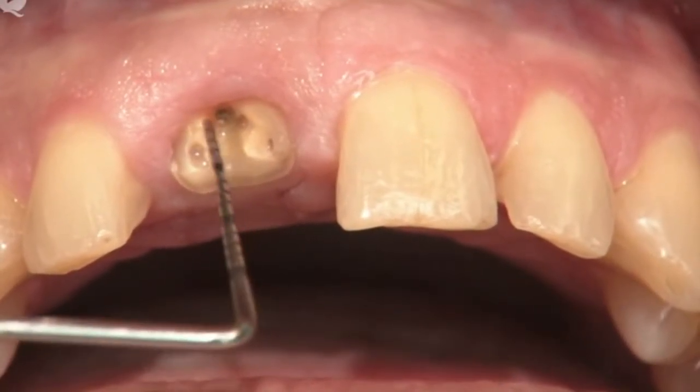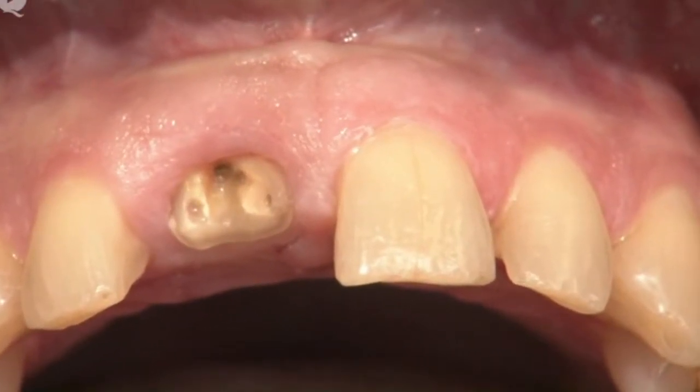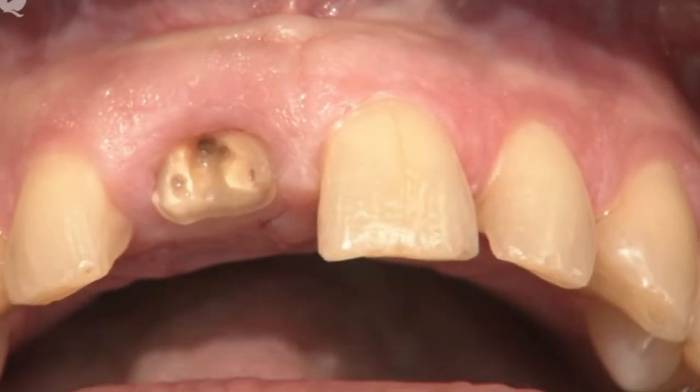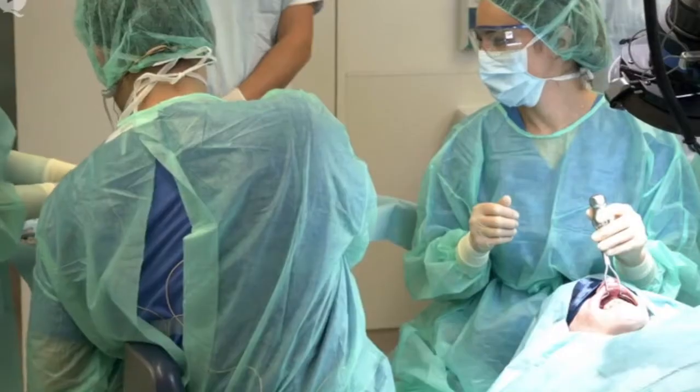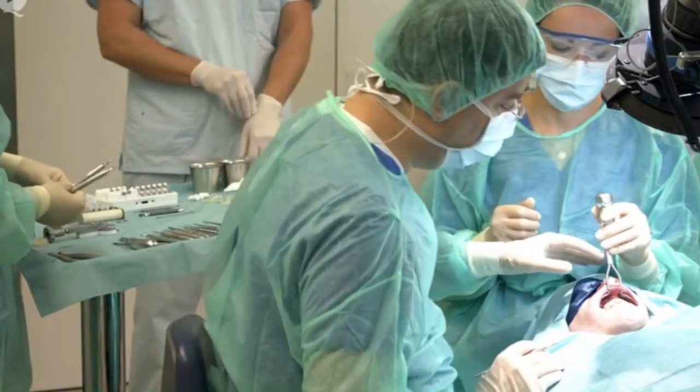You will note here that the tooth is fractured. This is a root-filled tooth, so in our eyes this is a low risk patient and therefore we would absolutely consider immediate implant placement. Now let me walk you through this step by step.